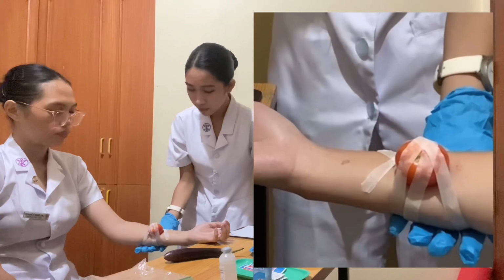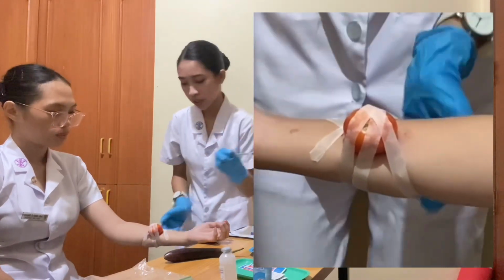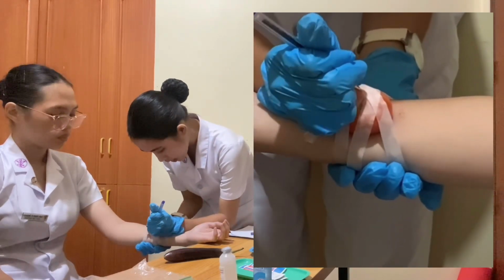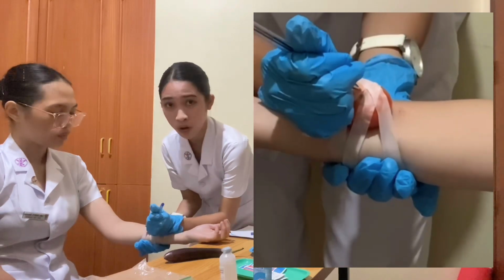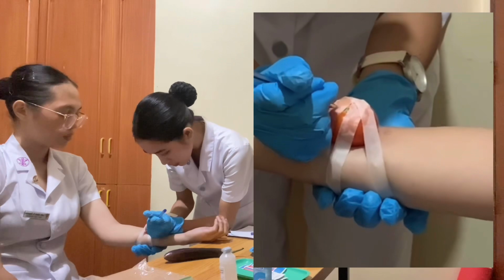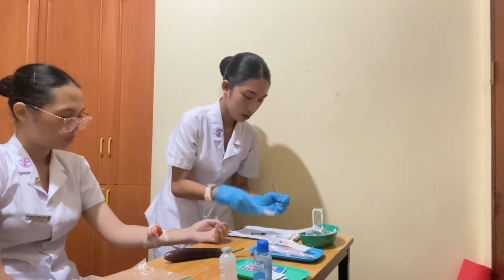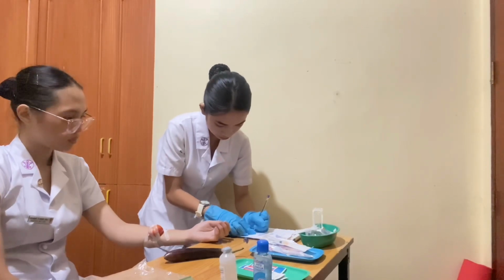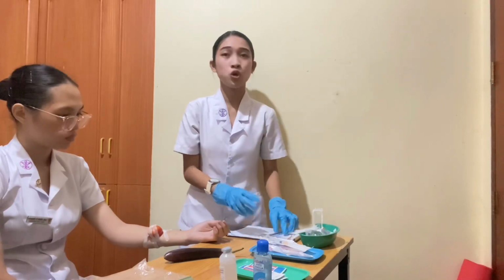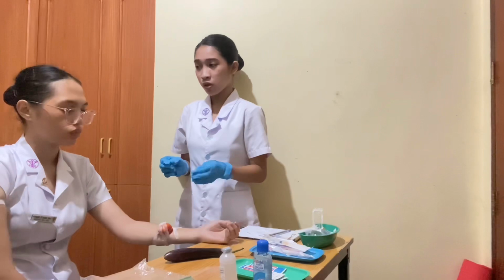And then I'm going to encircle it. Ma'am, mag-encircle ko, ha? And then, note the time of injection. Okay. 6:15. Okay. 6:15 p.m. Okay. Now, ma'am, do not massage the area, ha, because it will swell.